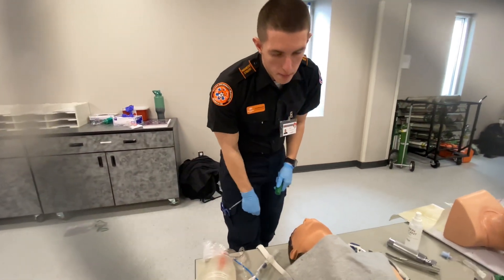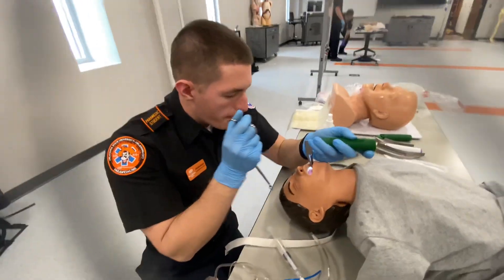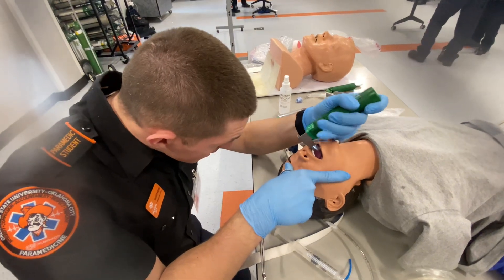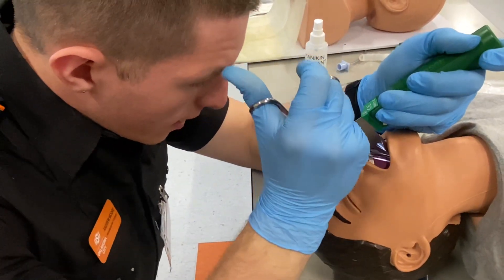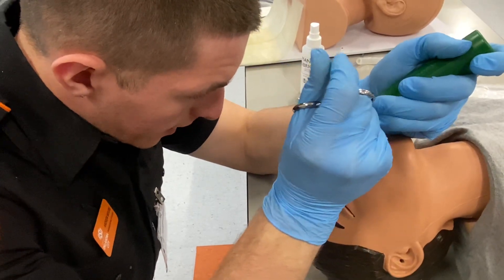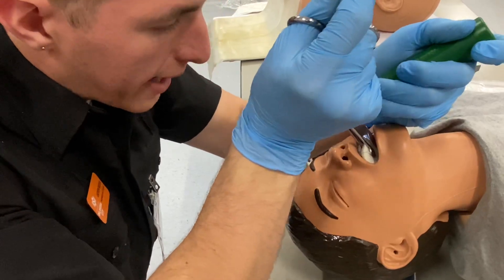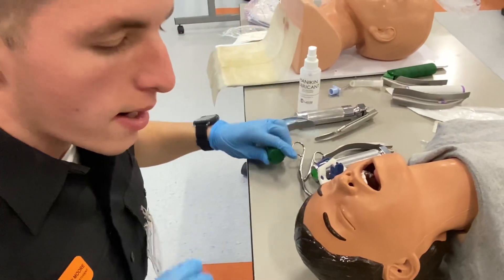We already tried BVMing them and it didn't work, so we're going to go in. We're going to walk it down the tongue. See the trachea? I do see the trachea here. We're going to get this foreign body out of there, making sure I don't use the teeth as a fulcrum. We're going to take this out.